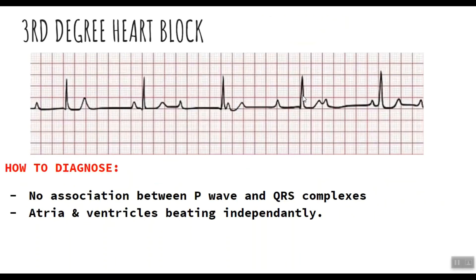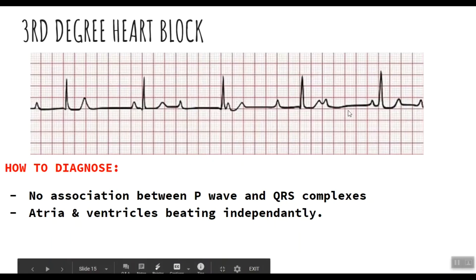Moving on to the third and most severe type: third degree heart block. In the ECG pattern of third degree heart block, there is no particular pattern and no association whatsoever between the P-waves and QRS complexes. For example, there is a lonely QRS complex without any P-wave behind it, and a lonely P-wave with no QRS complex next to it. This dissociation occurs because the atria and ventricles are beating independently of each other at their own pace.